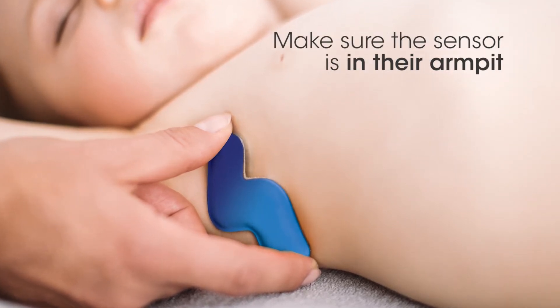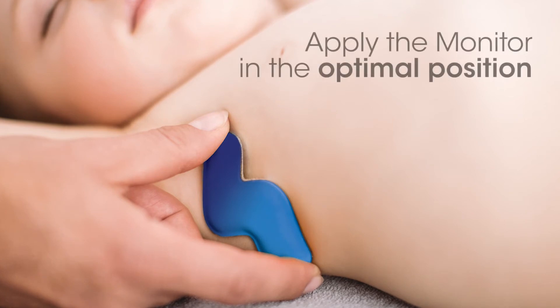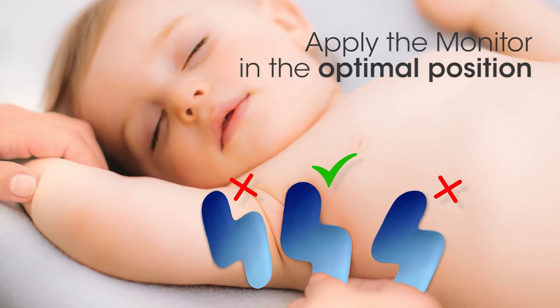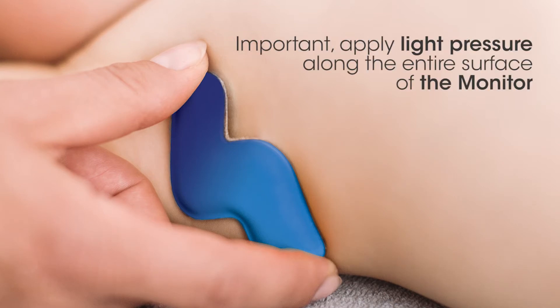Make sure the metal sensor is in their armpit — this is important to give the most accurate reading. The monitor is flexible so it will be comfortable for your child. Ensure you apply the monitor in the optimal position. The following positions may not give you an accurate temperature reading. The monitor should be securely stuck so it stays in place.